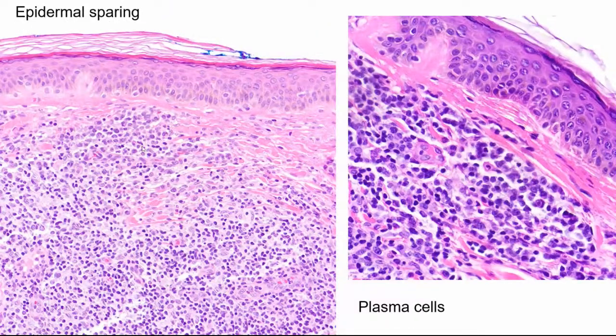And here again, the epidermis is beautifully uninvolved, and we have a dense infiltrate of small lymphoid cells, perhaps a few pale admixed histiocytes. And if you look up here and then over here, just beneath the epidermis, there are a fair number of plasma cells. You can see them here, there's a binucleate one, it looks like, with their eccentric nuclei. Here's one nice dark nucleus, eccentric cytoplasm with the suggestion of a Golgi. So a lot of plasma cells in the infiltrate.